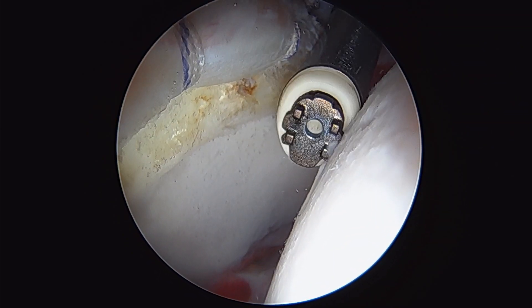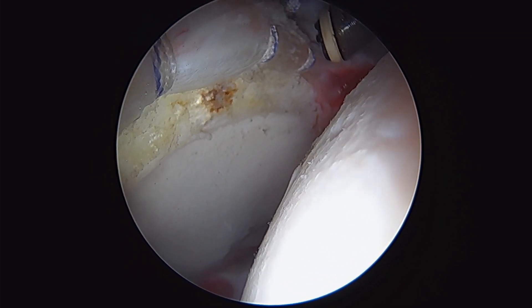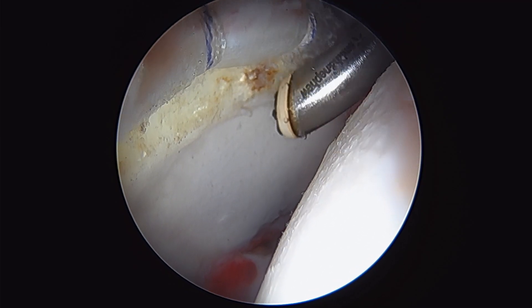This is a look at our final product after we've repaired the labrum. We used three anchors here, starting medially — one, two, three. Labrum's repaired.